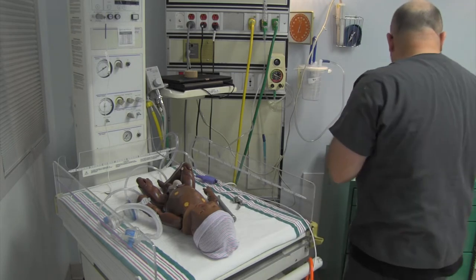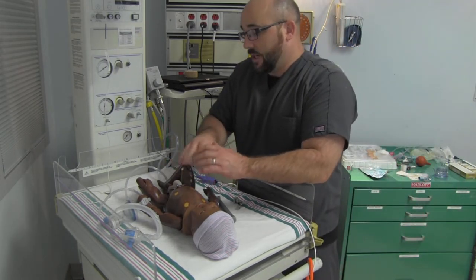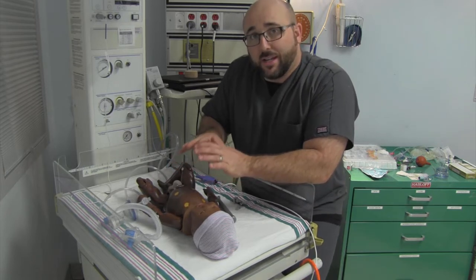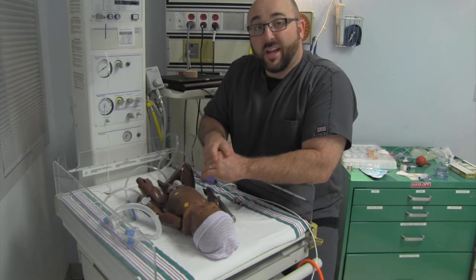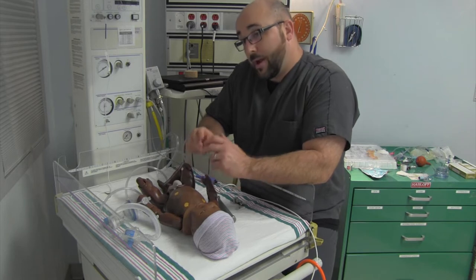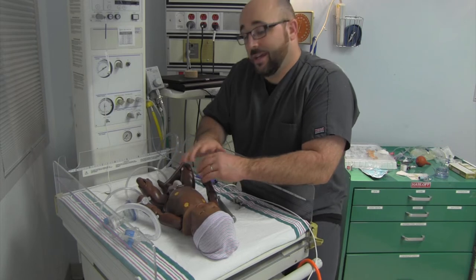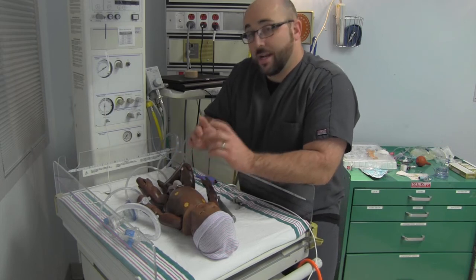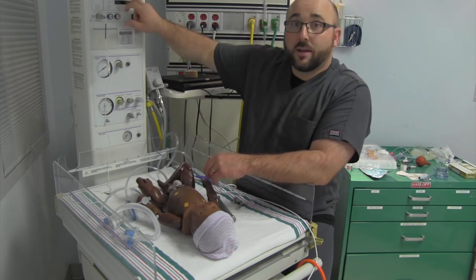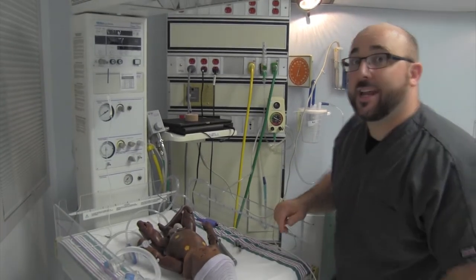Other things we'll need: a towel - some sterile towels if we have them - because we're going to warm, dry, and stimulate initially when this child is born, and look for respiration. So check respirations, check for a heart rate. Everything we do is really built around 30 seconds of positive pressure ventilation, so we're going to need to know when those 30 seconds are up. That's really important - this is going to be our timer up here.